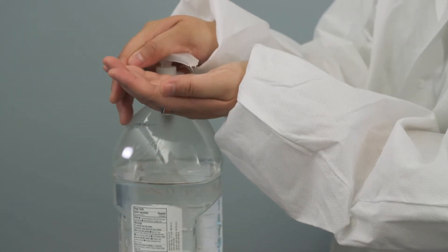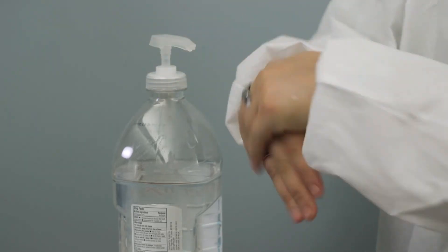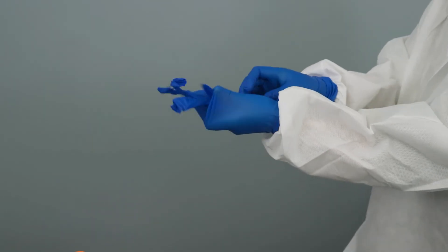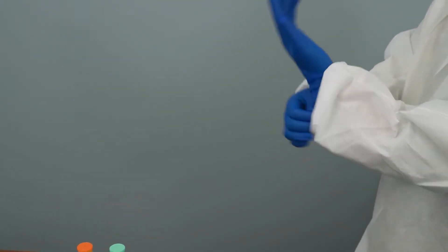Wash your hands with soap and water and then dry them or apply an alcohol hand rub. Then apply well-fitting, non-sterile examination gloves.